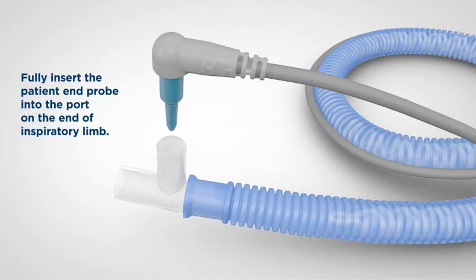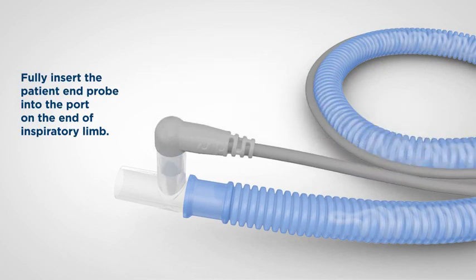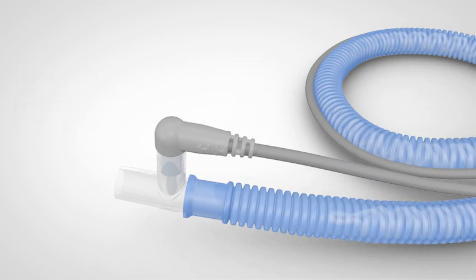Insert the temperature probe into the temperature probe port at the patient end of the inspiratory limb. It is important for correct function of the system that the probe is inserted fully — you will notice that there is no blue probe plastic showing outside the circuit and the grey plastic is seated against the probe port. We have now set up the inspiratory limb.